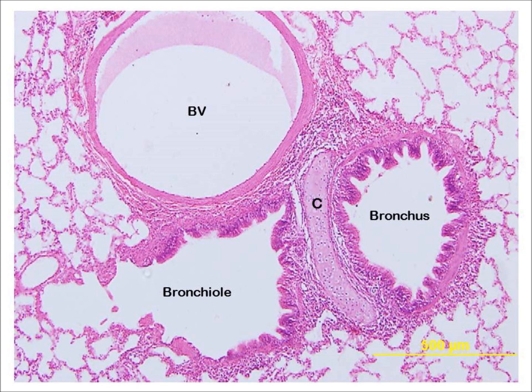Now, in this section, the cartilage stains eosinophilic, but in other sections, it will be very basophilic. Note that the cartilage has a slight curve to it, and the concave surface is next to a bronchus that is lined by a thick respiratory epithelium. The convex surface of the cartilage is next to a bronchiole that is on the left here. Remember, cartilage is found in the walls of the bronchi, but not the bronchioles. However, in this particular case, the bronchus just happens to be located next to a bronchiole.